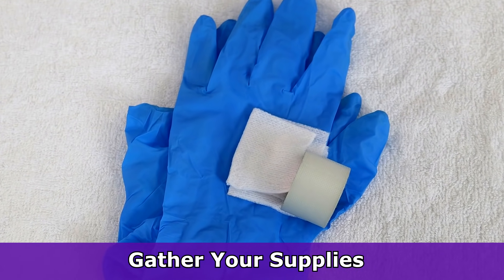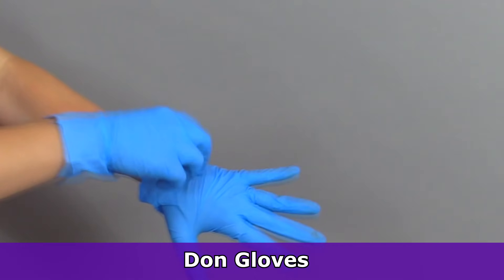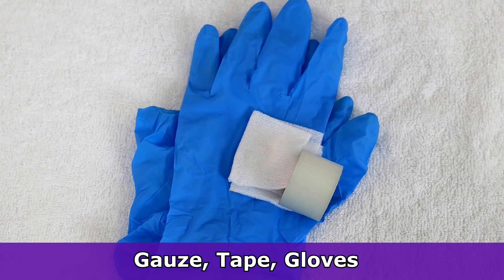To perform this skill you'll want to gather your supplies, perform hand hygiene, and don gloves. The supplies you'll need will be gauze, tape, and gloves.